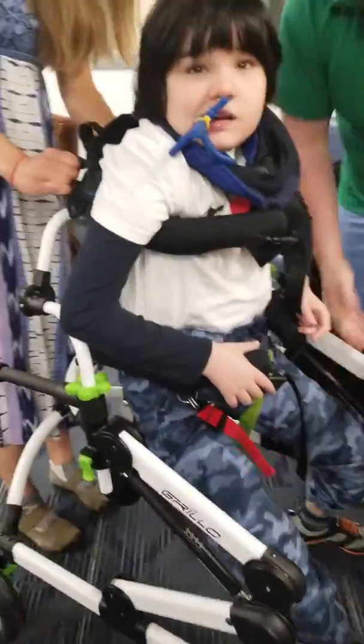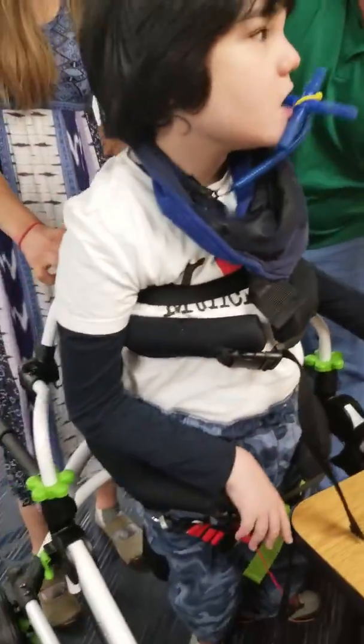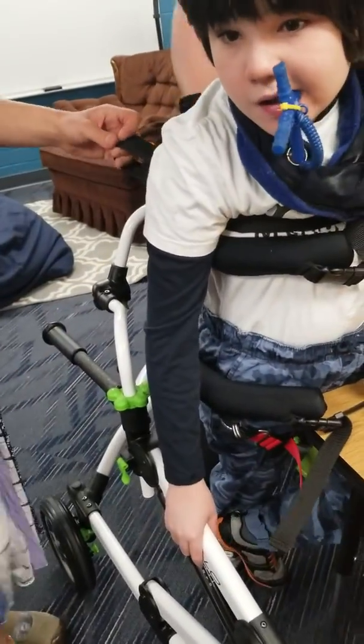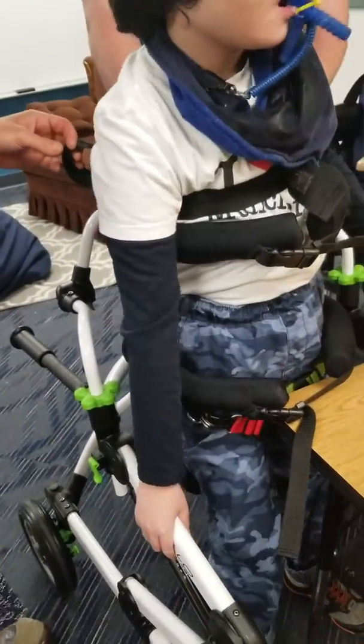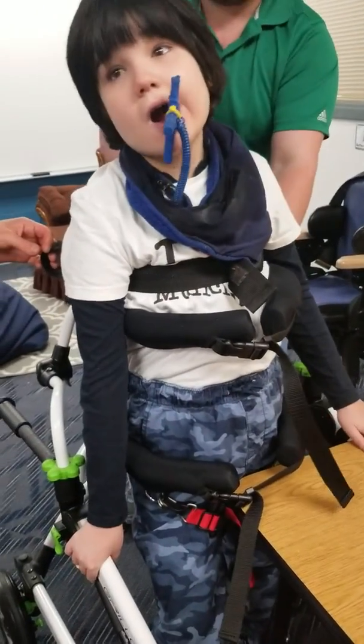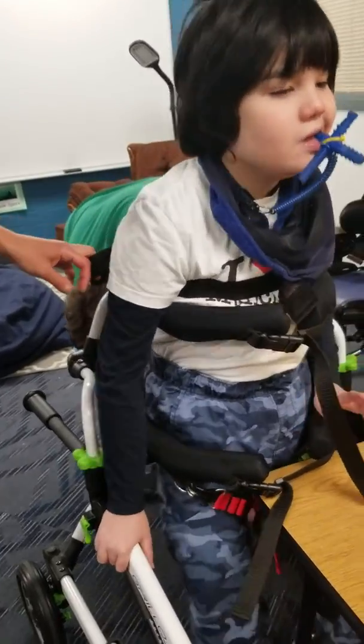Oh, I'm great. Alright, so let's stand up tall, Rafa. Okay, so you've got the happy belt up in his armpit. I'm just checking on placement because when we use it at home, or when we travel or on the horse, it's at his waist. That's all I'm checking. Actually, the one Ruffin's using is much wider than that.